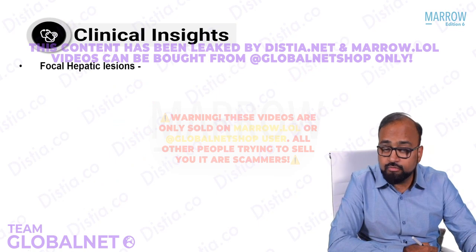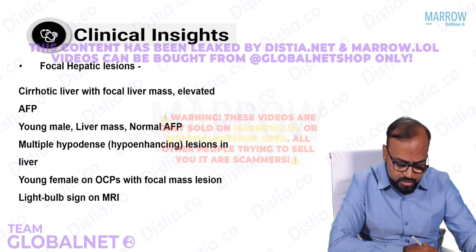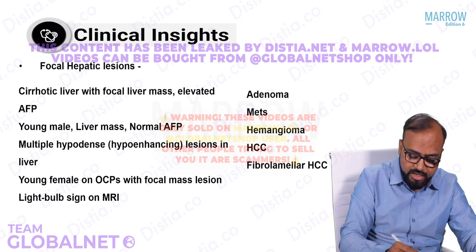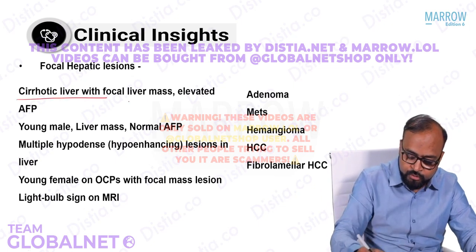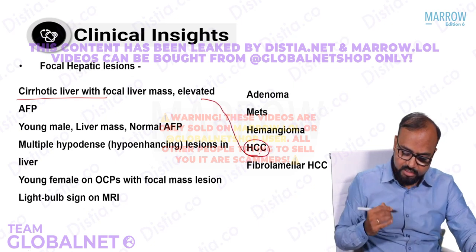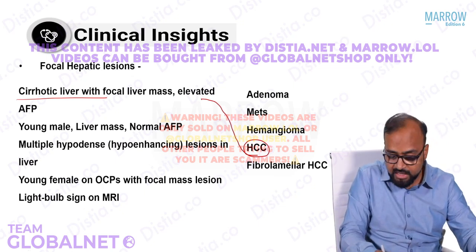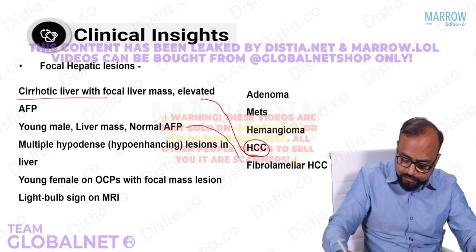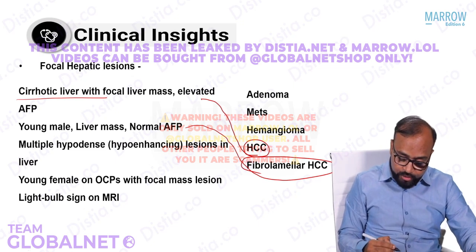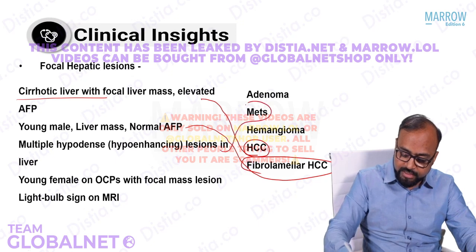Now see, there are focal hepatic lesions. Let us quickly have a look at them. Let us match the following. So a cirrhotic liver with a focal liver mass and an elevated alpha fetoprotein we have seen. Any mass in a cirrhotic liver is HCC, I told you, right? Elevated alpha fetoprotein also fits. So this is going to be HCC. Young male with a large liver mass, right? With normal AFP, central calcified stellate scar, this could be fibrolamellar HCC. Multiple hypodense or hypoenhancing lesions within the liver is a very characteristic feature of liver metastasis.